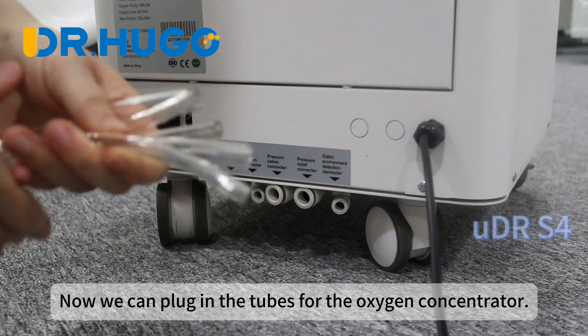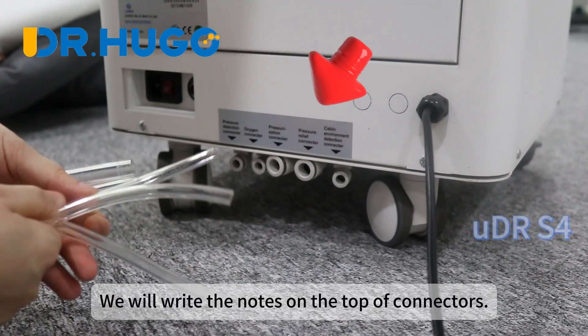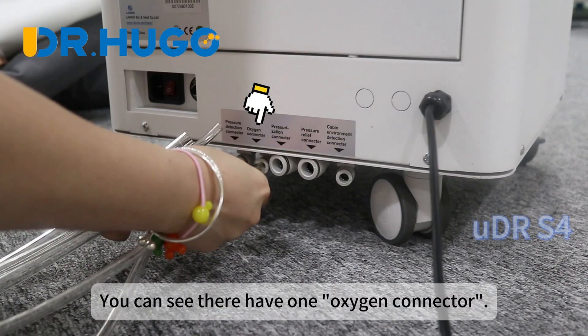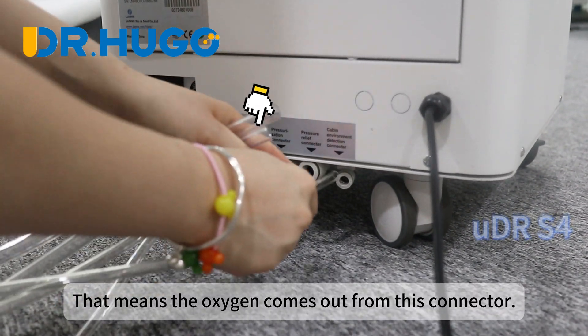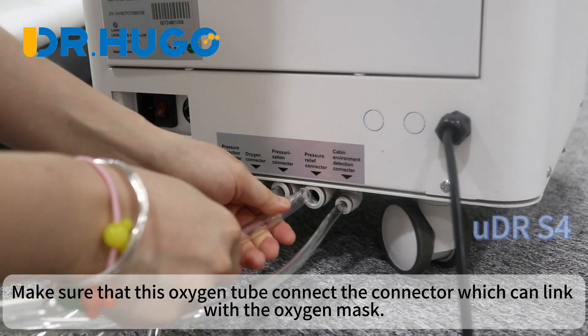Now we can plug in the tubes for the oxygen concentrator. We will write notes on the top of connectors so you can know what function each connector serves. You can see there is one oxygen connector — that means the oxygen comes out from this connector. Make sure that this oxygen tube connects to the connector which links with the oxygen mask.